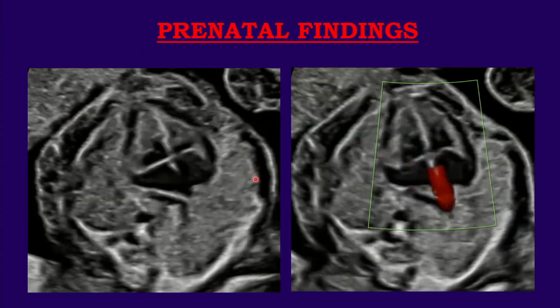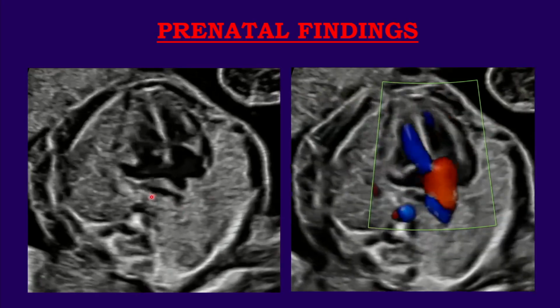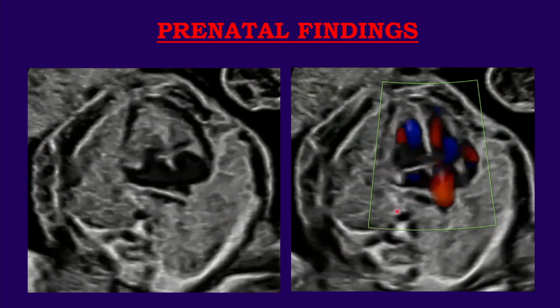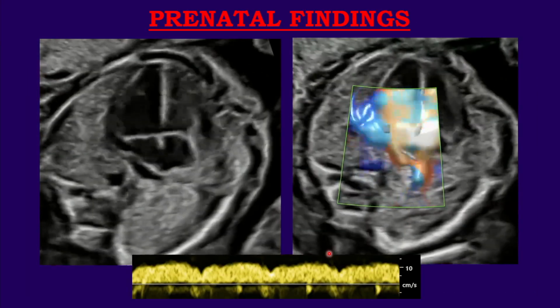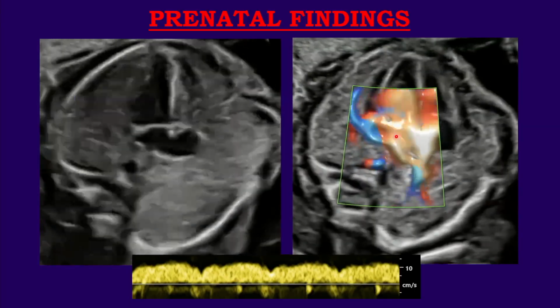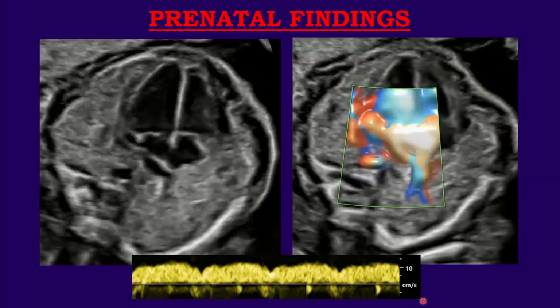So then we change the angle of scanning a little bit and we can see more details. You can see that behind is a linear structure, and this linear structure is most likely vascular. So what do we do next? We put color on, we are trying to connect that vascular structure, and it seems very misleading because it looks like it's basically connected to the left atrium. But we are following our protocols.